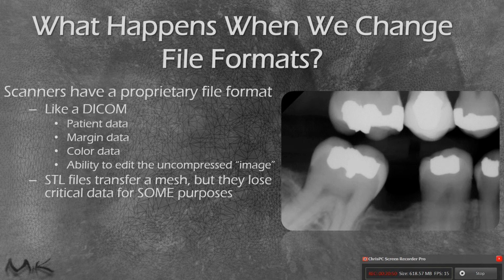Now, certain scanners, I believe like PlanMeca, have a ditching function that's actually built into the software when you export a crown and bridge file, which is excellent. And I think a lot of other manufacturers should probably do that as well. But those are some of the things that you lose.